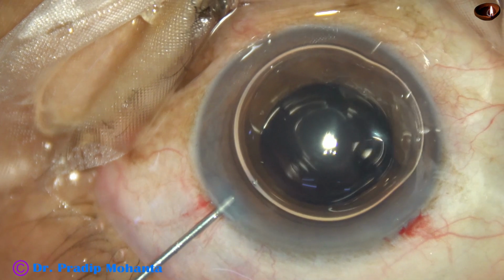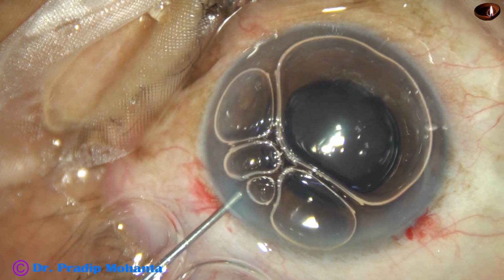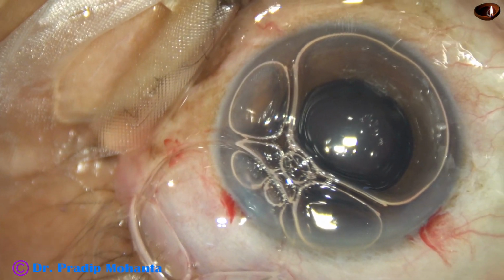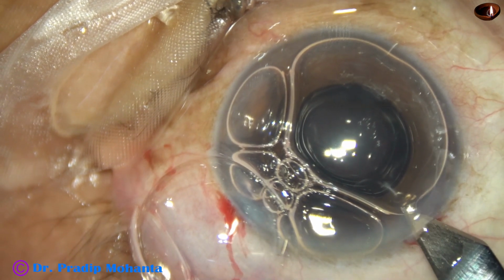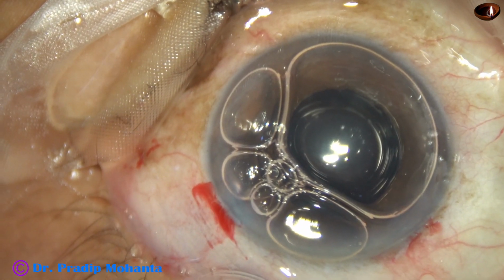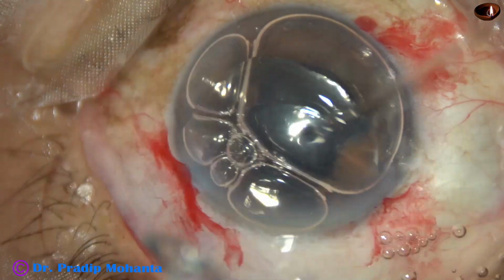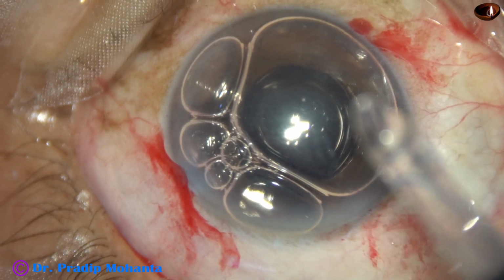And now my plan is to implant a multi-piece intraocular lens under air, because if I use visco now, a lot of visco will go into anterior vitreous, and if the vitreous is liquefied, a lot of visco will go much behind. So we can implant the intraocular lens under air in this way.